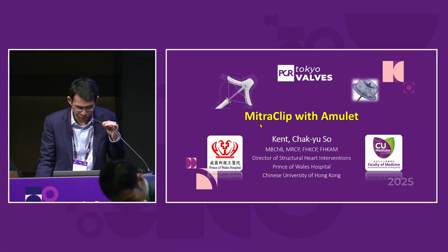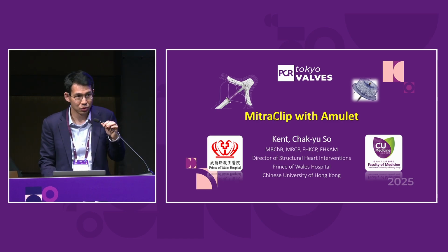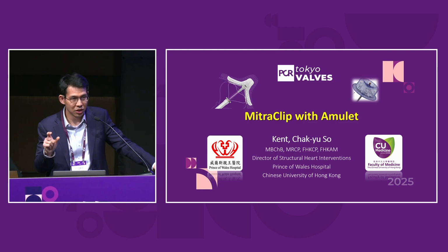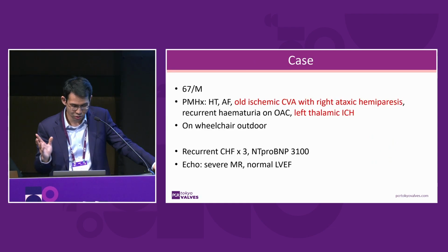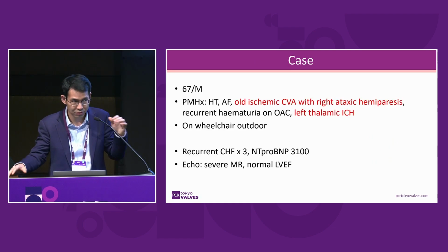Thank you. I think Andrew has set up a very good platform to start with, mainly that concomitant MitraClip and left atrial appendage occlusion is all about the septum. And the most important anatomical thing is the different direction of the target of treatment. So here's my disclosure. I'm going to present the case first, and then we'll have a bit of a discussion.